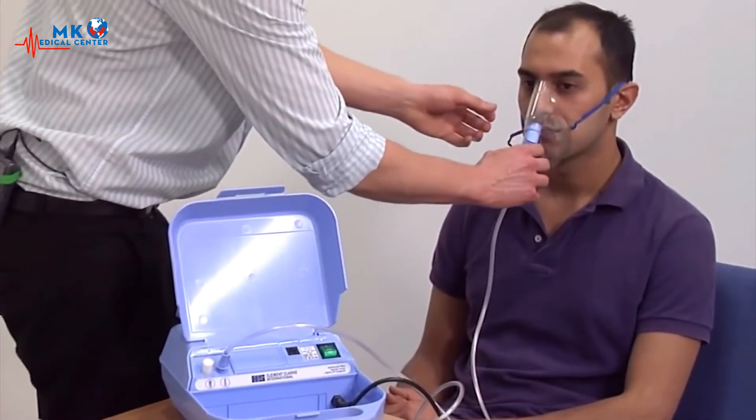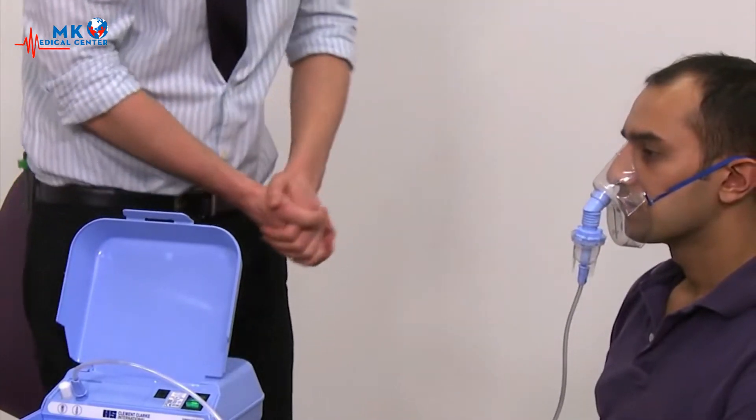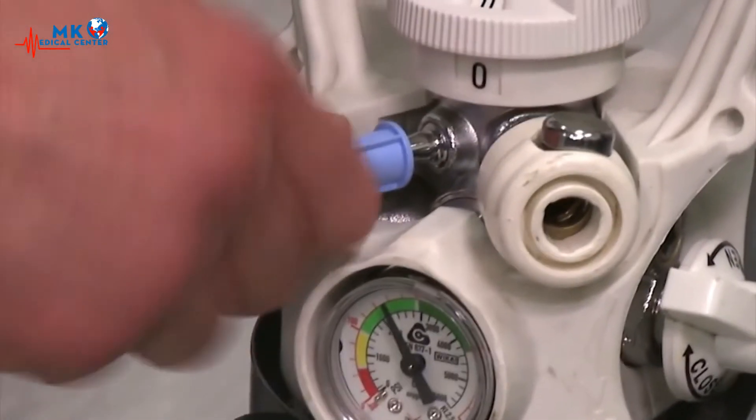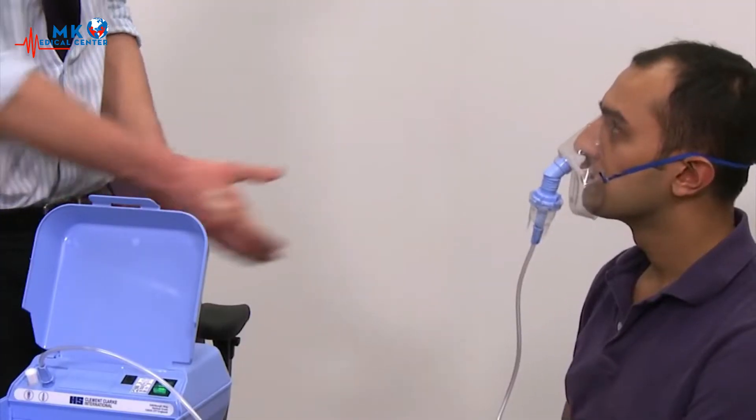If the patient requires oxygen therapy, the nebuliser chamber and mask can be directly connected to the oxygen outlet for simultaneous delivery of oxygen and nebulised medication. The oxygen flow rate should be between 6 and 8 litres a minute.